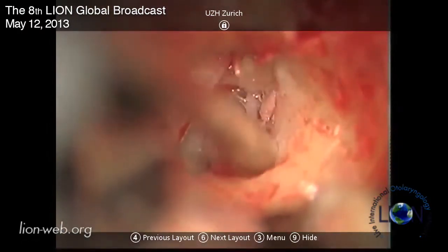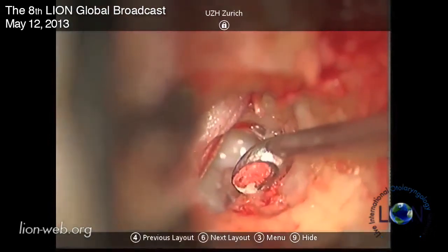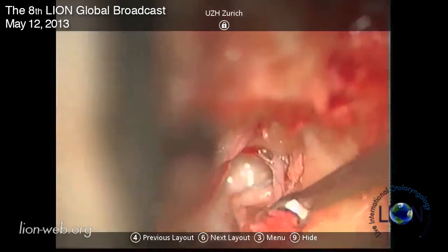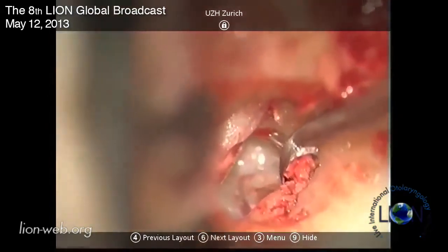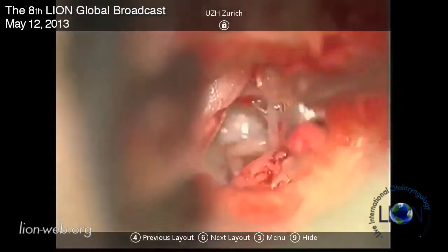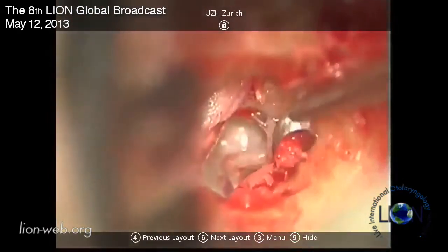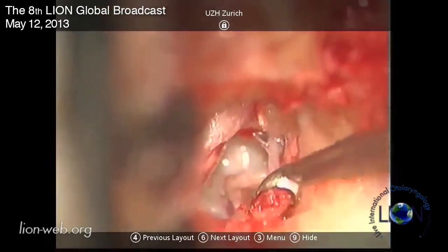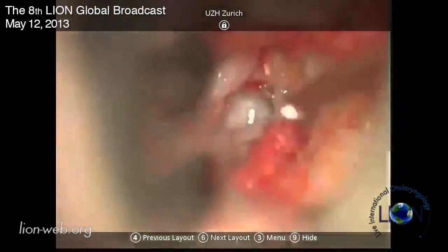It's much safer than using a drill, and the other thing is you don't have to set up a drill for just this very short period of time that you need it. I take as much bone off so that I can actually see the facial nerve and the pyramidal process, while of course preserving the chorda.